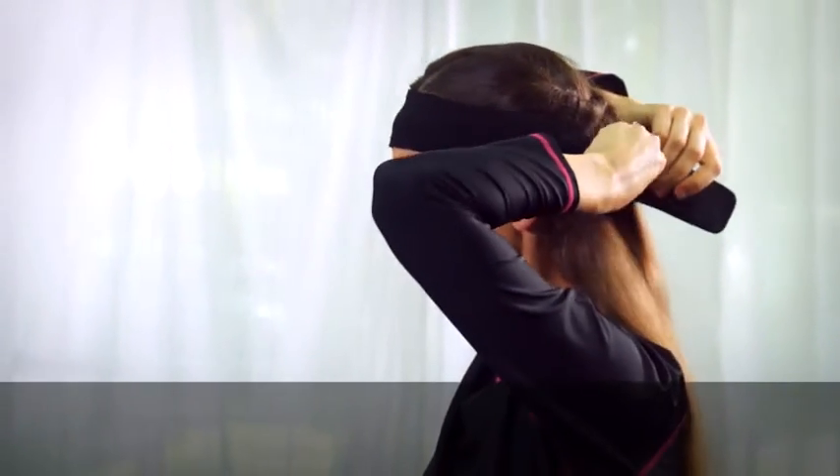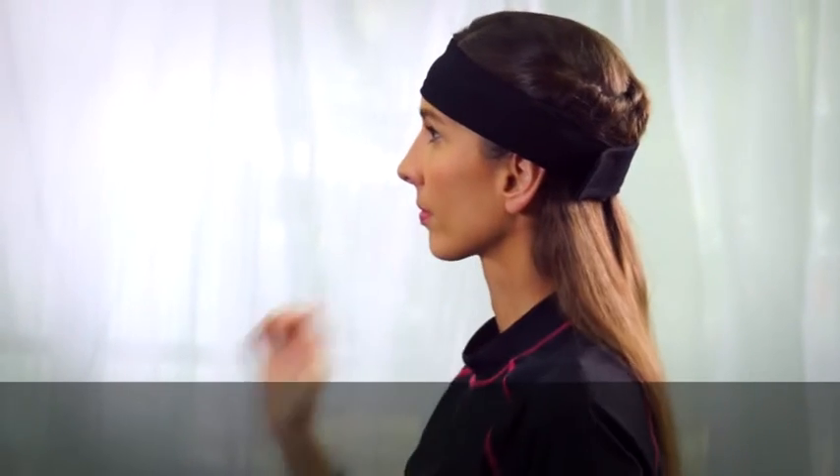Place the headband on your head, taking care that the processor is placed over the implant.